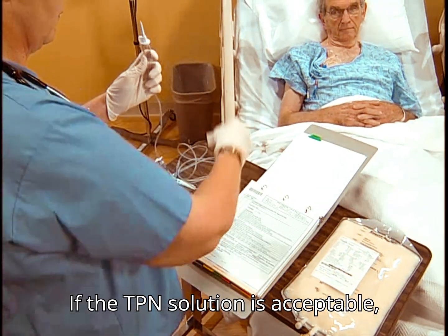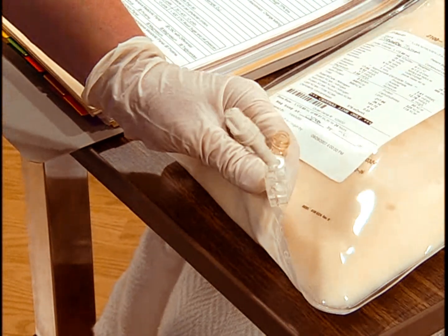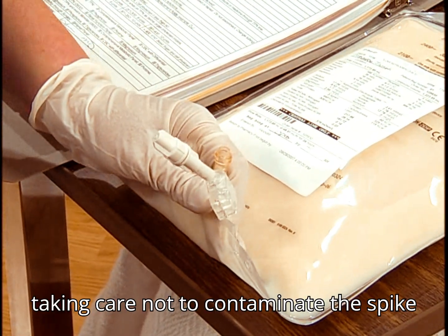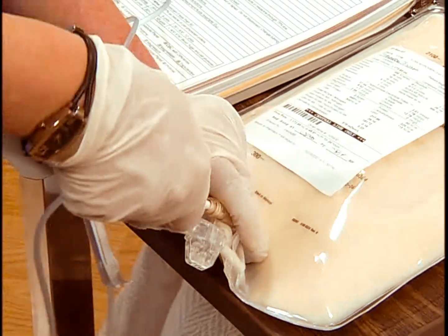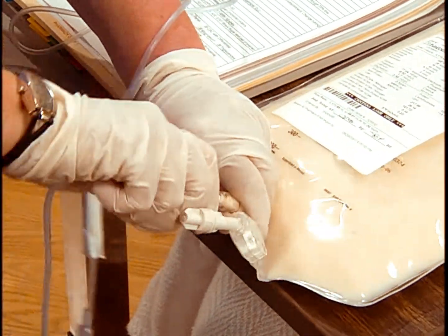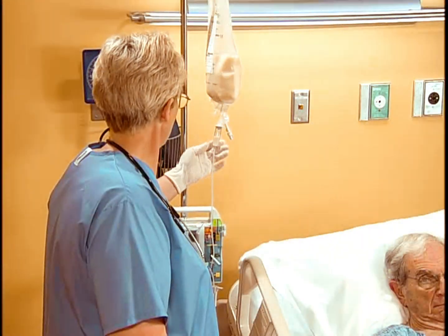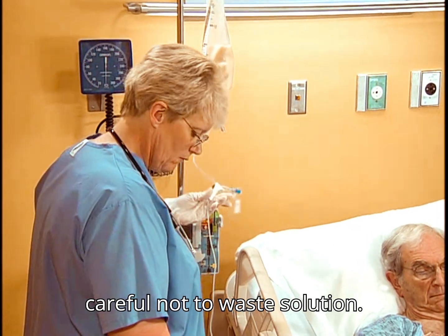If the TPN solution is acceptable, connect it to the IV tubing and filter, taking care not to contaminate the spike or bag port. Now prime the tubing, being careful not to waste solution.